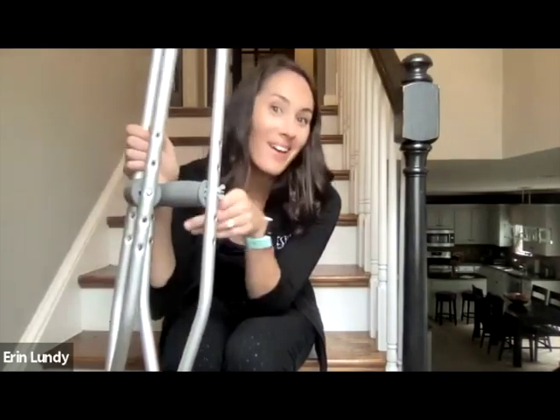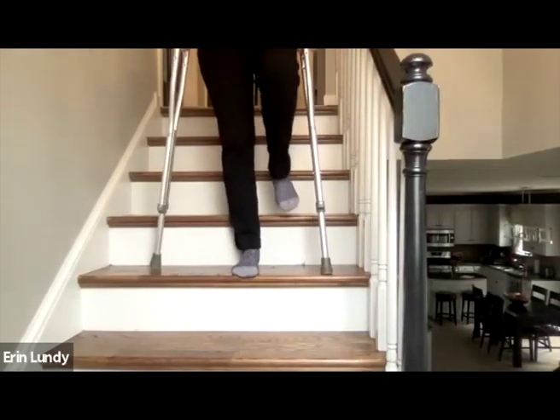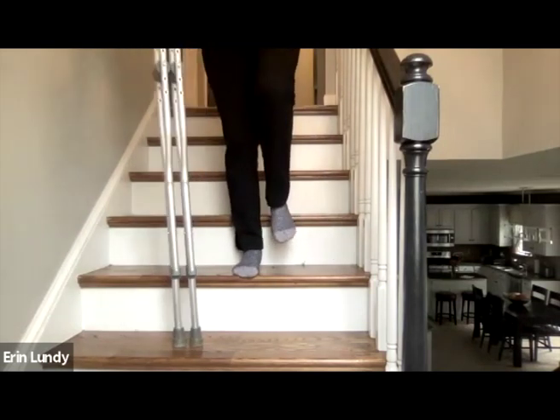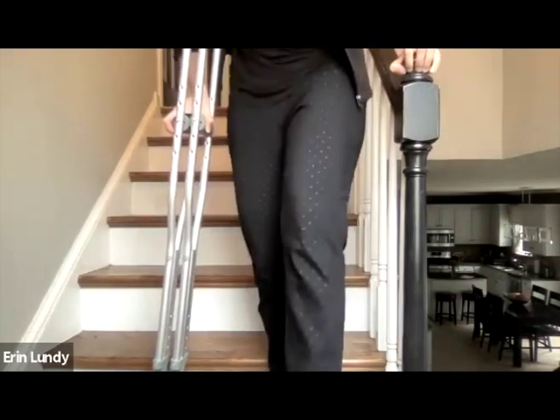And now for the more challenging part, which is going down the stairs. First I'm going to show with a handrail, which is a little easier, and then we'll show going without a handrail. Let's say you have a handrail. Standing here, not allowed to put any weight on this leg. What you're going to do is transfer your crutches to your other side. Use the handrail here and go down. Like that. And this is how I got down the stairs when I tore my meniscus, which was a fun experience. So I have an intimate relationship with these crutches.